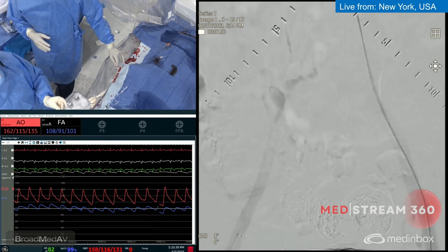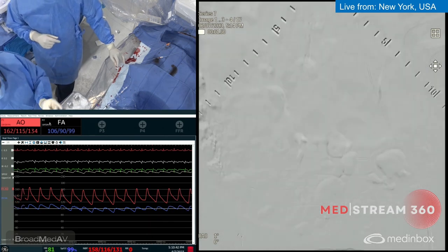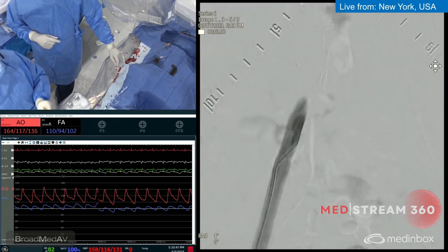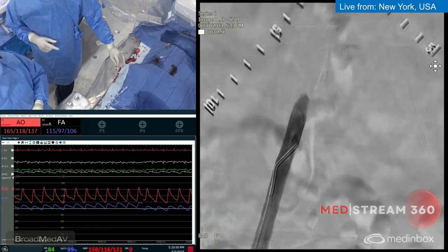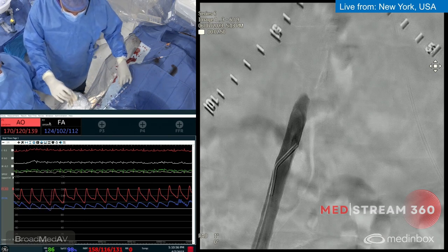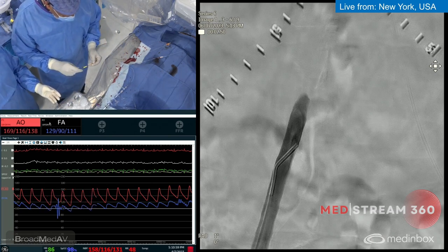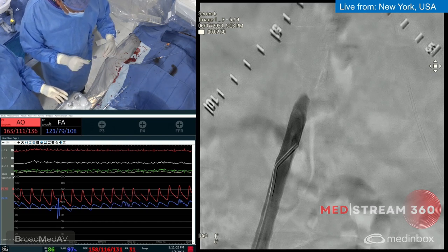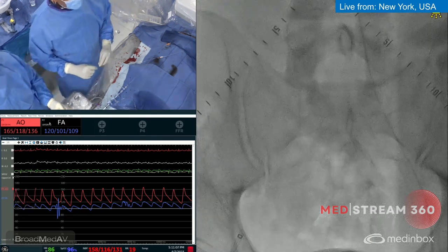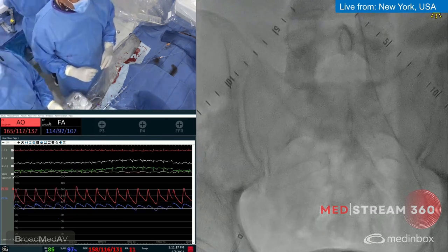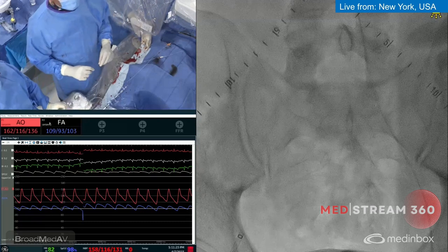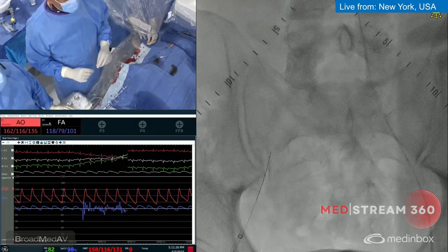The diagnosis is a dissection of the common iliac — when I went with my catheter and injected, you can see stagnation of flow ipsilateral. The concern now is whether I'm in a dissection plane from below, which makes this much more difficult than anticipated. I don't want to stent the dissection plane, which would create a major issue. I'm going to go with a Command wire. This appears to be a chronic retrograde dissection that probably closed at the level of the ostium, now filling through the internal iliac.